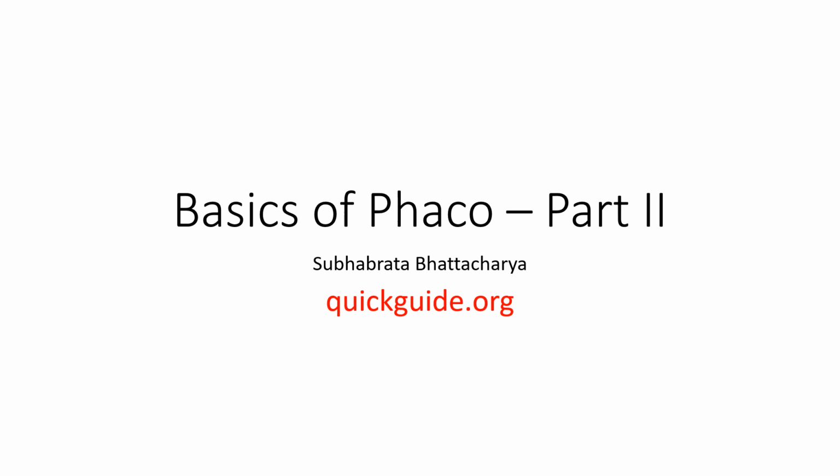We also talked about 3 basic principles of Phaco, and that any good Phaco machine has to satisfy these 3 basic principles. What are those 3 basic principles? Inflow should be more than outflow, or at least equal to the outflow. Second, less turbulence inside the eye, which can happen due to a mismatch between the inflow and the outflow. And third, less heat buildup at the incision site so that the patient gets a clear cornea postoperatively.